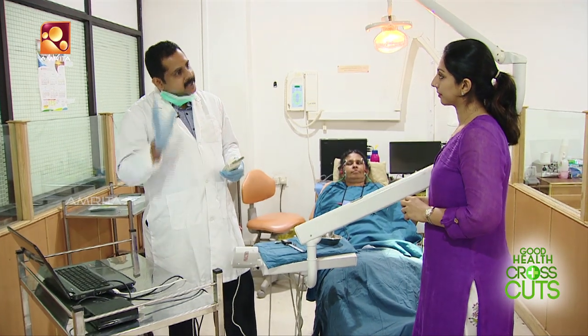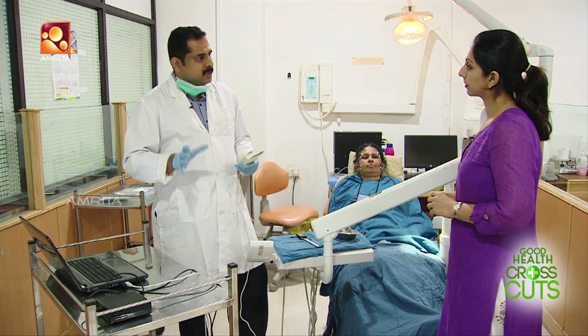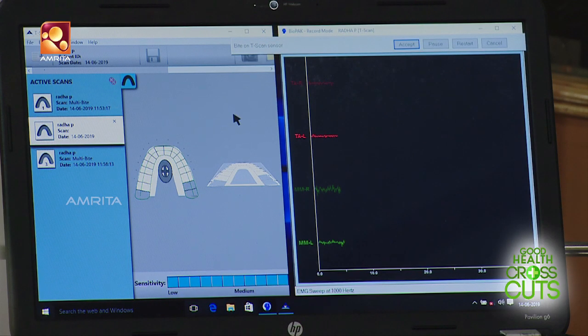In the right-side window, there is muscle activity — this is EMG activity. It is simultaneously linked with the T-scan data. We can fire the muscle and, using the right-side window, diagnose and treat appropriately.